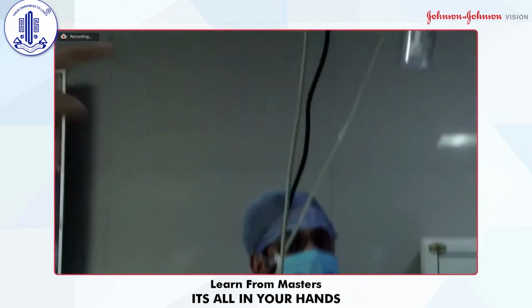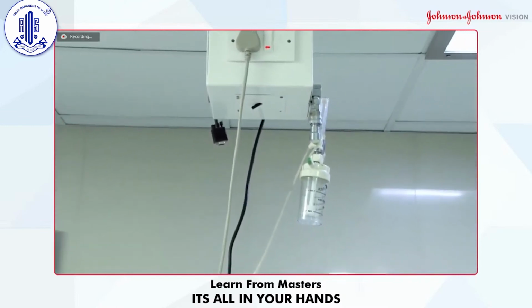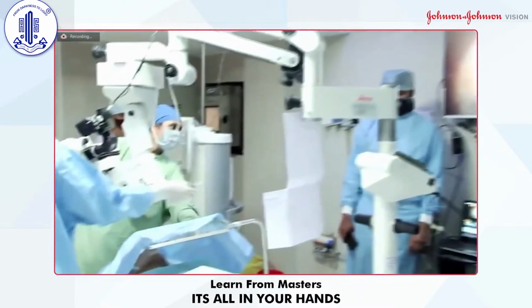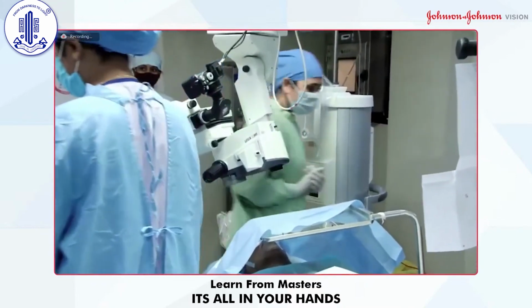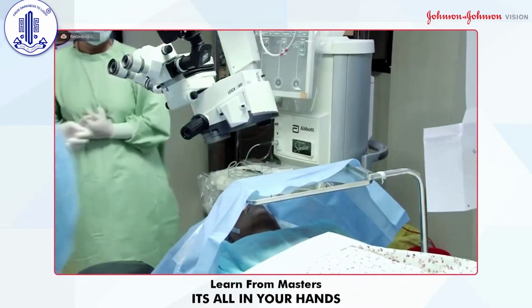This oxygen. Can you see the oxygen pipe which is coming? Yes, sir. So same is coming. You can see up to this. You can focus here. Okay, this is going there. Patient is getting the oxygen below the drape. Okay, got it. That's the reason of a slit.